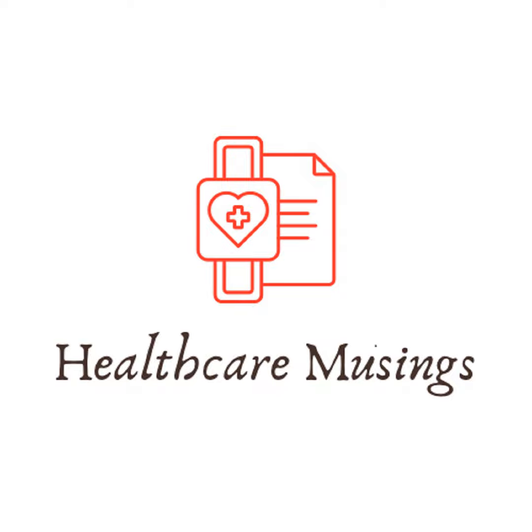So that was very uncomfortable because the patient is bucking the ventilator. It's not working with the patient. Now it's called assisted volume control, meaning when the ventilator senses the patient wants to take a breath, it delivers the breath at the tidal volume you set. The respiratory rate is a backup. So if you set a rate of 20, for example, but the patient doesn't want to breathe 20 times a minute, they'll get 20 breaths. If the patient wants to breathe 25, they'll get 25 breaths at whatever tidal volume you set. That's now called assist control, or volume control, assisted volume control.